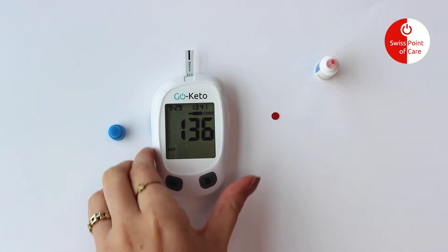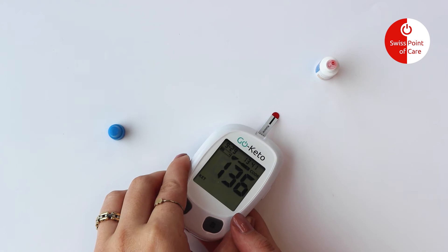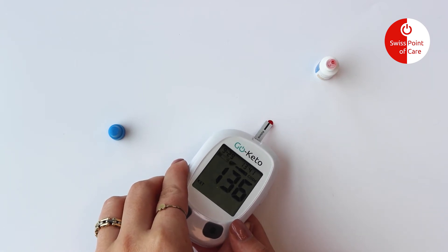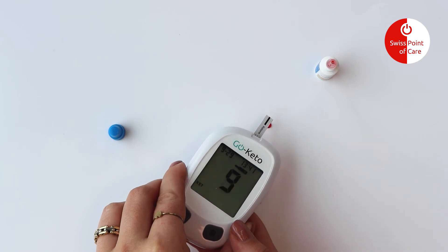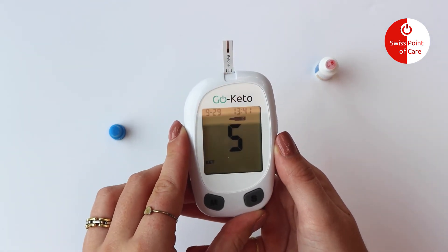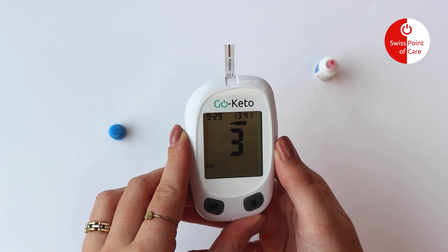Touch the sample tip of the test strip to the control solution drop. Once a sufficient sample has been applied, the display will count down from 5 to 1 for glucose and 9 to 1 for ketone.